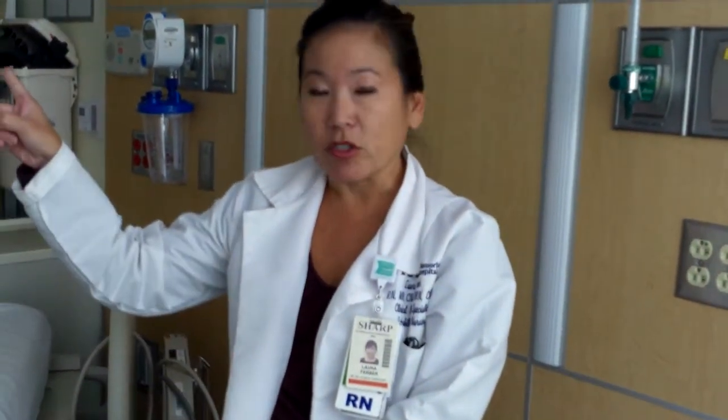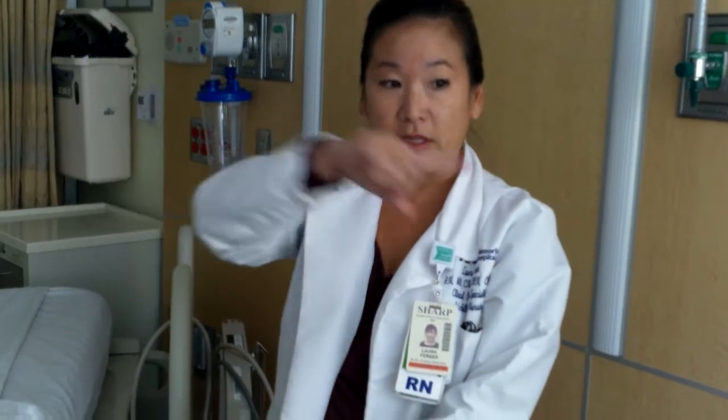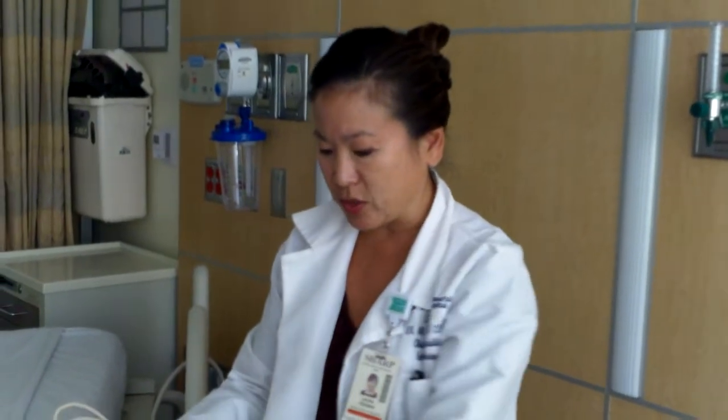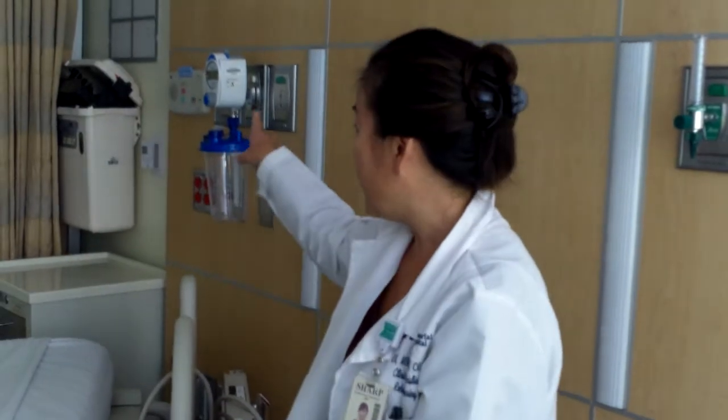So again, just as a reminder, when it alerts, it will come off as a regular call to the nurse call system. It won't be an emergency. Just remember that when you bring your patient back, to connect it to the wall. Also, you need to cancel it at the wall too.